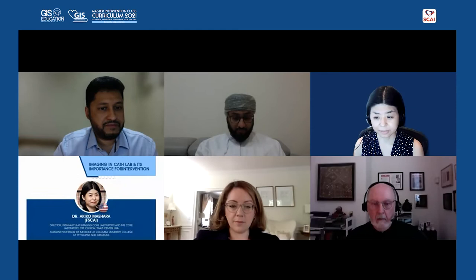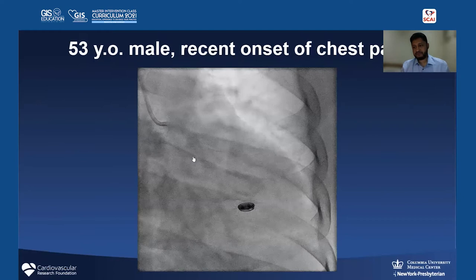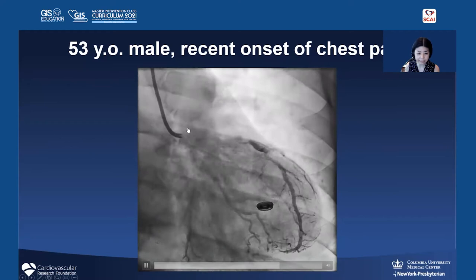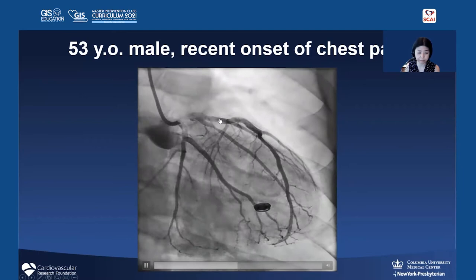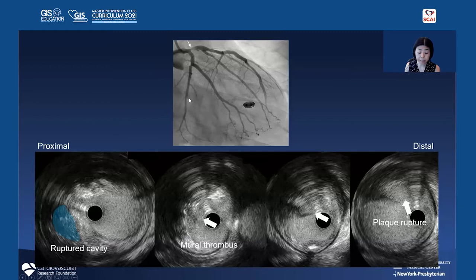Let's start with a case. This is a 53-year-old male with recent onset of chest pain. You can recognize the proximal LAD is quite tight, with some oscillation and reduced flow compared to the other artery — very suspicious for a vulnerable plaque. Corresponding to this ulcer, I can see a plaque rupture in the proximal LAD, also a cavity in the left domain — this is a chunk of mural thrombus, a truly ongoing thrombotic event.